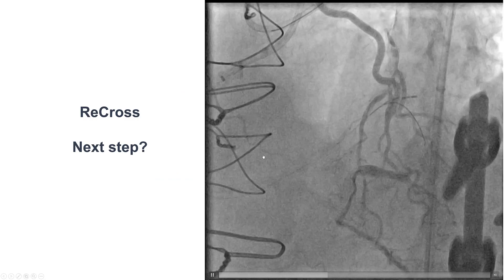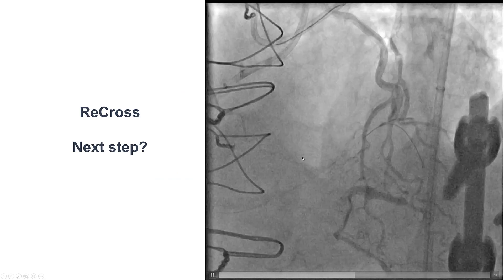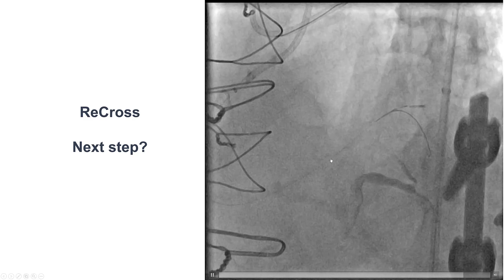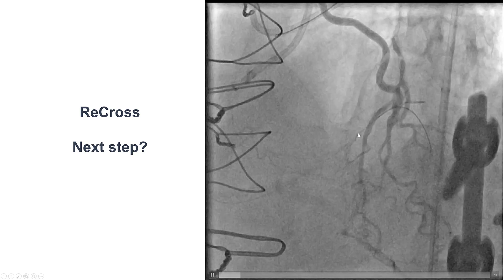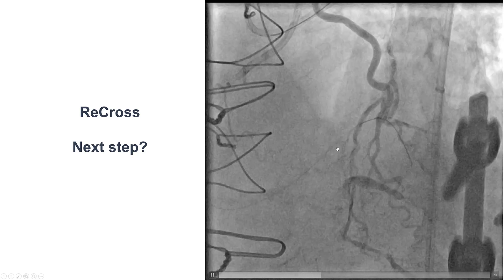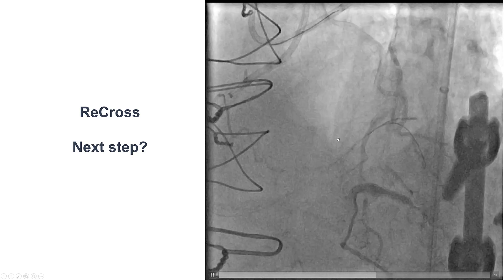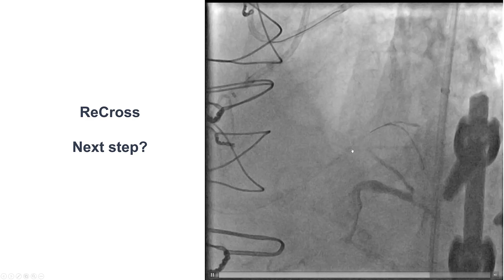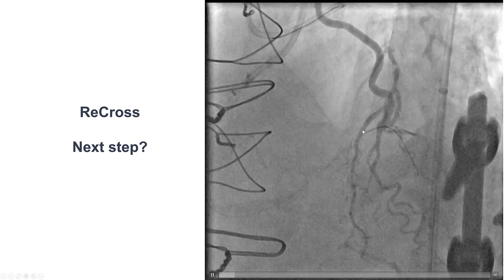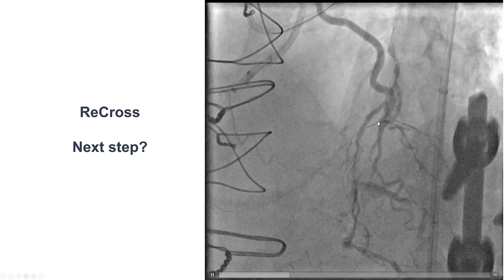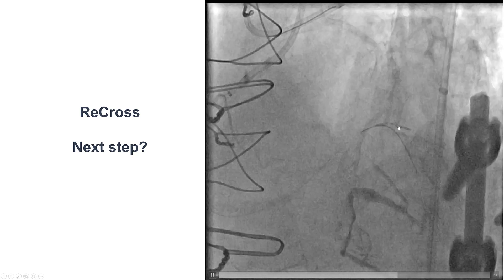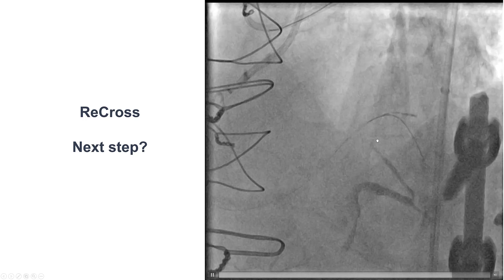After multiple attempts, we tried to use the Stingray balloon — actually we used two Stingray balloons that got damaged in the process — but eventually we were able to get a ReCross dual lumen microcatheter that can also be used for re-entry. Then we had a surprise: we thought the knuckle would have gone into the posterior lateral, but now we saw that the knuckle had actually gone out, likely into a small side branch, which would become important as the case progressed.